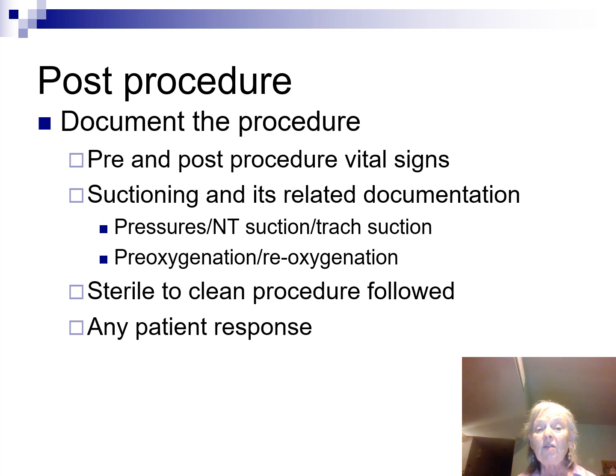We're going to talk about the fact that we had a sterile procedure and went to clean. And then we're going to look to see, was there a patient response to it at that point. Now, what I'm going to tell you is, this is the way we teach you to do trach care. When we talked about suctioning, that was the way we teach you to do suctioning.